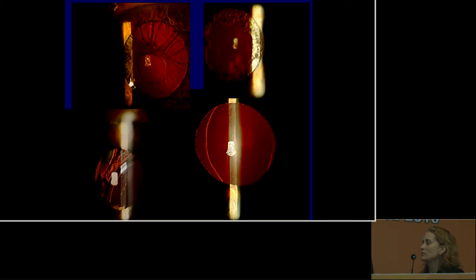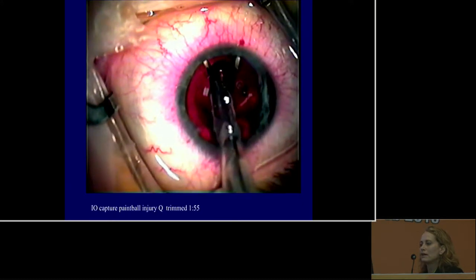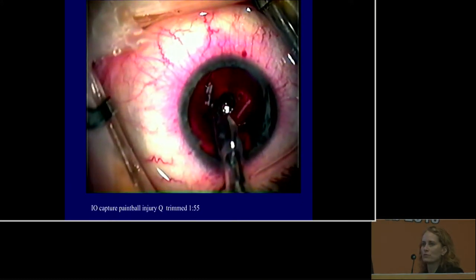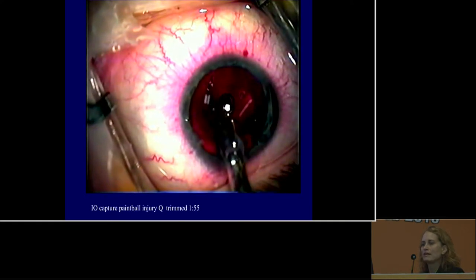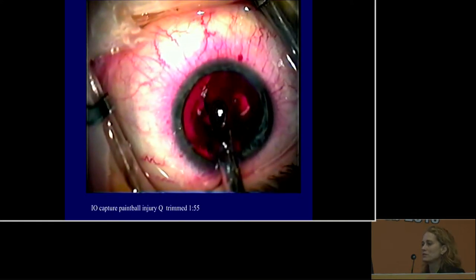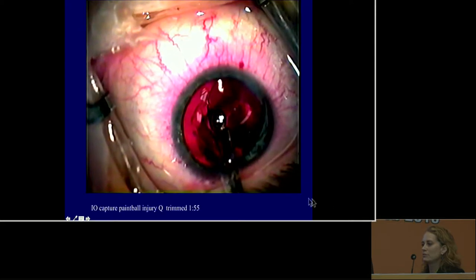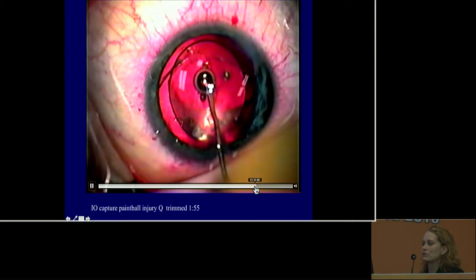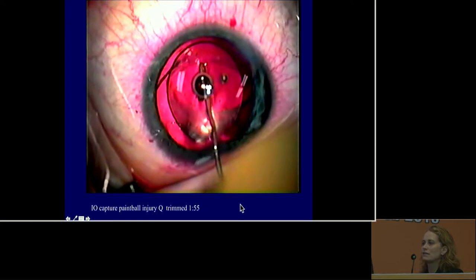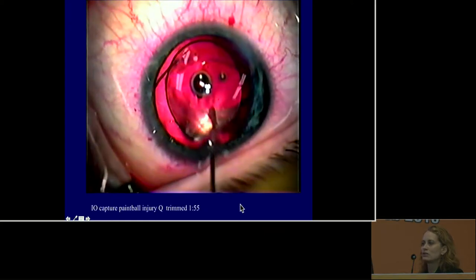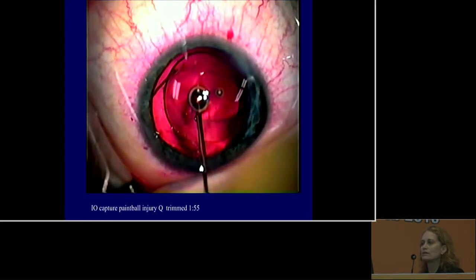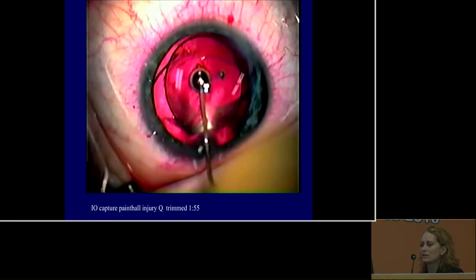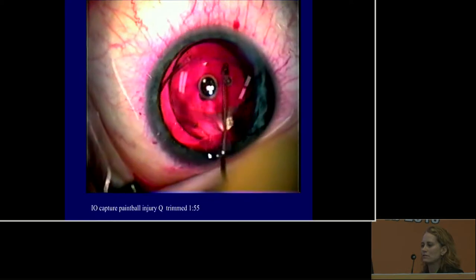This patient with a paintball injury had a rupture of the posterior capsule, and the IOL was subluxed through that into Berger space with good stability overall. The result shows very nice centration, open and clear visual access that lasts for the lifetime of the patient. Cases like this help us know this is a good idea.